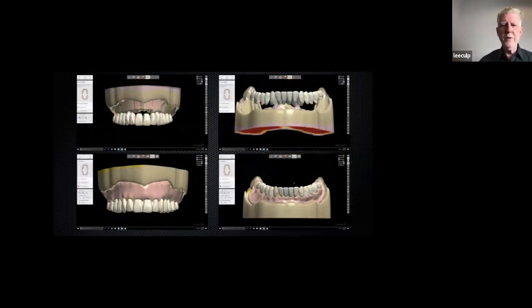Now, the tissue on the bottom of the teeth, it's difficult to see on this little picture, but around where the CEJ is, there's a little green line, which is the margin of the tooth. So on the denture, you've marked your denture base, and the teeth have a mark around the gingival areas. When you do your tissue, literally all you do is push a button and the tissue goes from your borders to your teeth and just fills in. I mean, it's one button, your tissue's there.